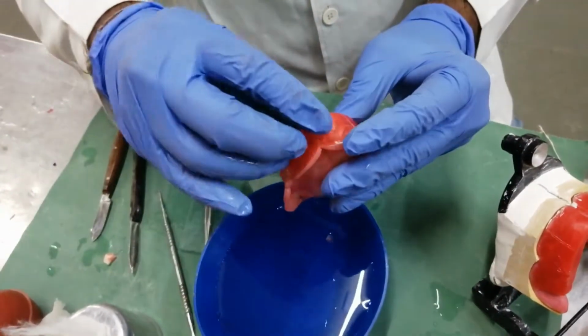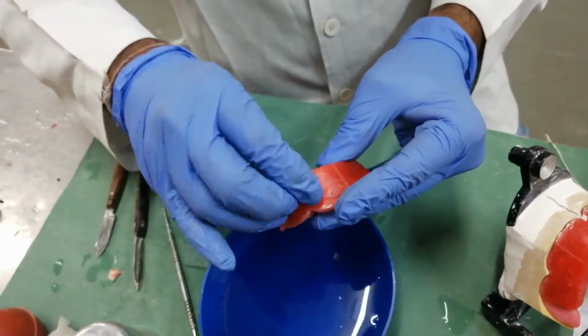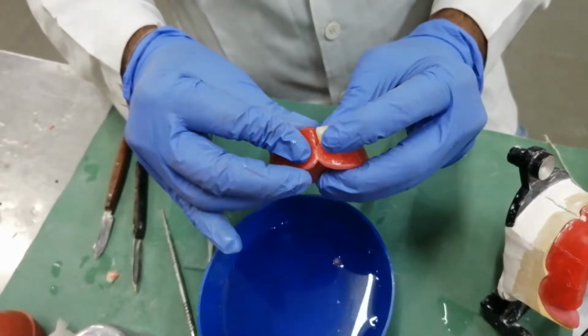Now you have to place the central incisor into the prepared socket according to the central incisor's inclinations.